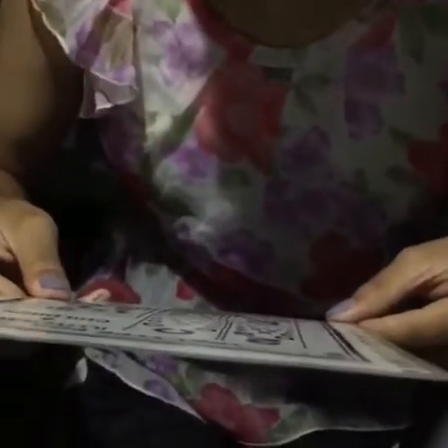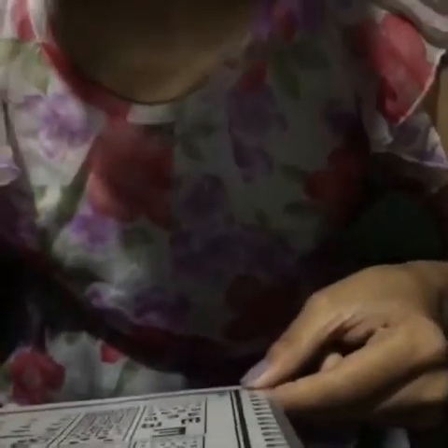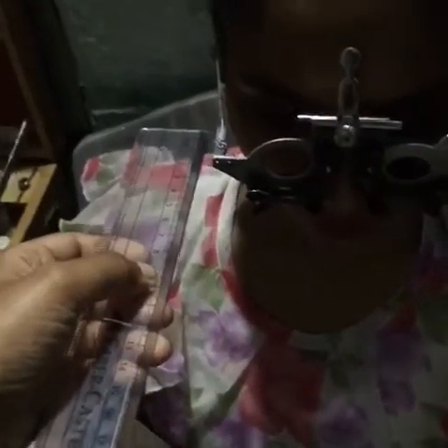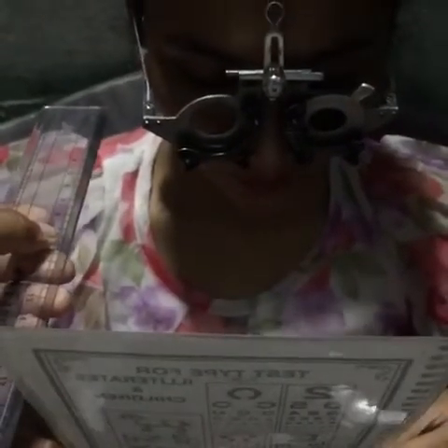So let's hold the scale so that we can find out the distance. From the eye level we will hold the scale like this, okay. So now please move the chart towards your eyes gradually and report to me when you see blur.